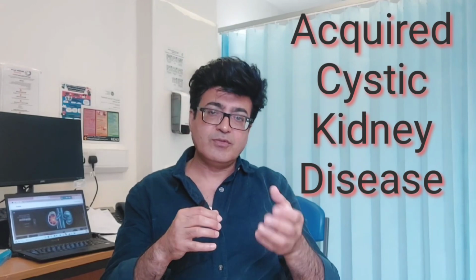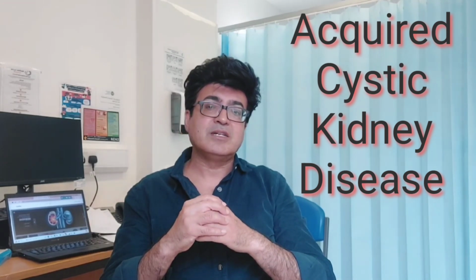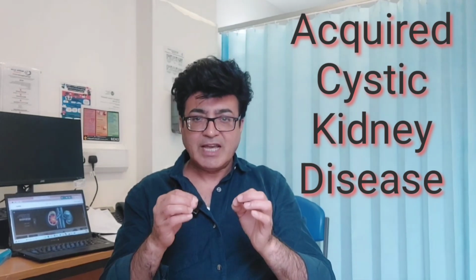How can we appreciate it on ultrasound imaging, how will it look? It will normally look like the cyst you normally see, as a serous cyst, or you might see it in some other forms. But the main criterion is the history: there will be a history of chronic renal disease and a history of dialysis.